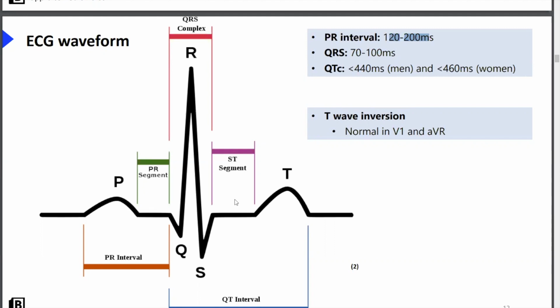And bonus points, typical med school question. Patient comes in with chest pain, young patient comes in with chest pain. The ECG shows diffuse ST elevation. What's the diagnosis? Diffuse ST elevation in a young patient with chest pain. Pericarditis. Yes, very good. That's bonus points. And again, we're going to come on to all of these rhythms, so don't worry if you have no idea what I'm talking about. We're just doing the basics now. We'll come on to disease later.